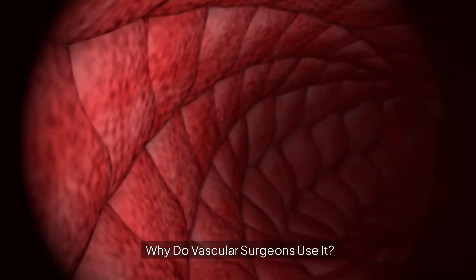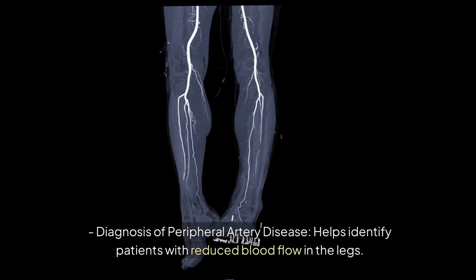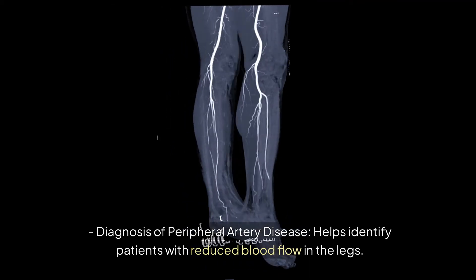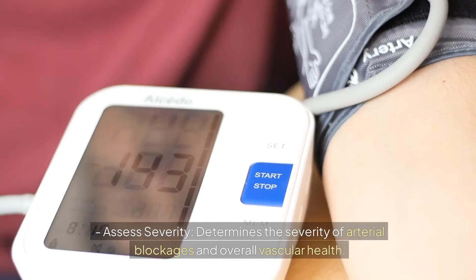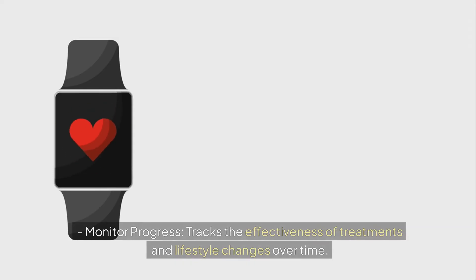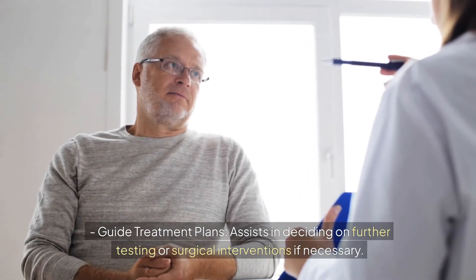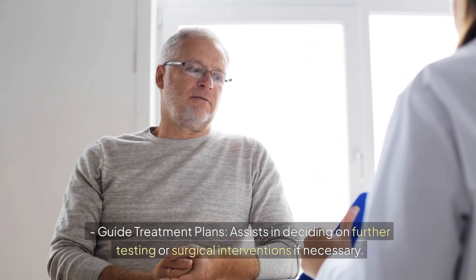Why do vascular surgeons use it? Diagnosis of peripheral artery disease: helps identify patients with reduced blood flow in the legs. Assess severity: determines the severity of arterial blockages and overall vascular health. Monitor progress: tracks the effectiveness of treatments and lifestyle changes over time. Guide treatment plans: assists in deciding on further testing or surgical interventions if necessary.